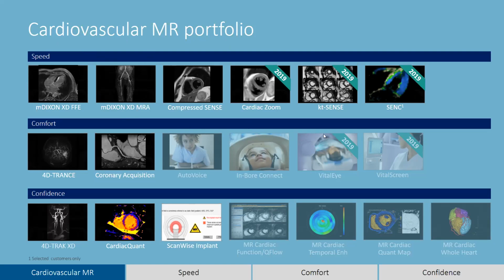It detects, with artificial intelligence, the breathing and the cardiac motion, and these parameters are implemented during the acquisition in the console of the technician, and would be very useful in some cardiac disease and inspiration or something like this.